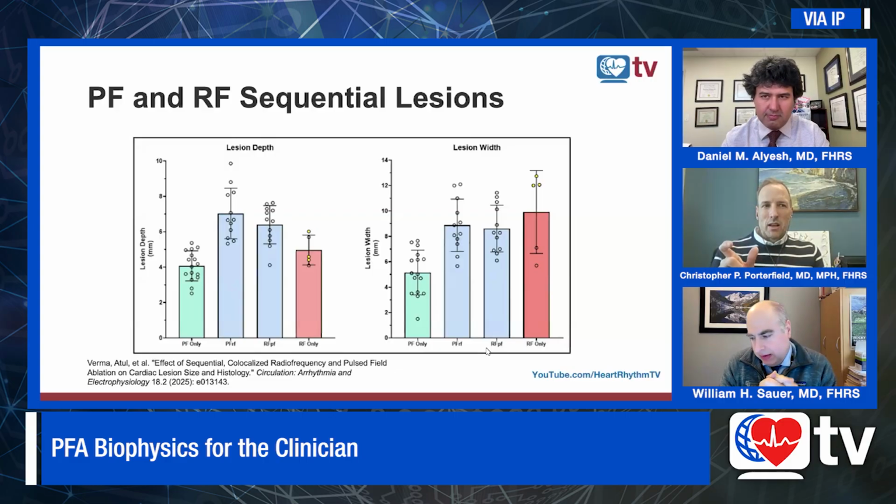That will be the only caveat, but we'll be in the ventricle. The only thing we're going to worry about maybe is the coronary, but we won't be worrying as much because we've done thermal injury with RF for quite some time in that space.